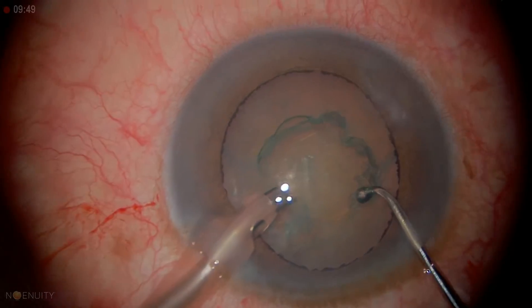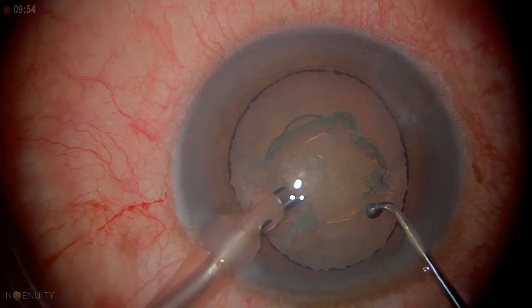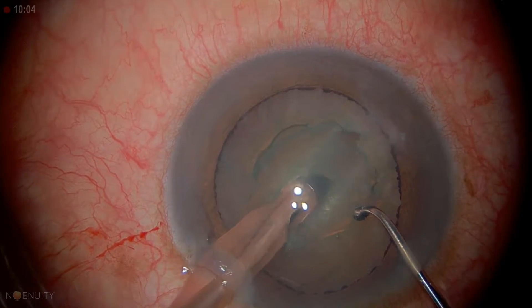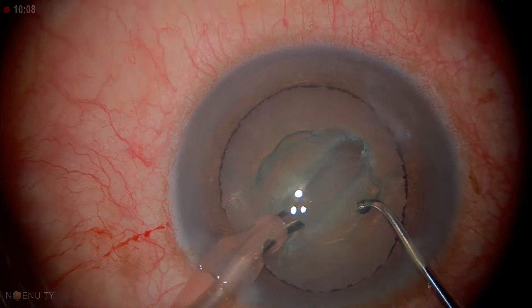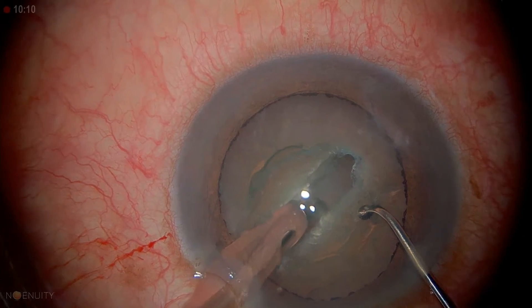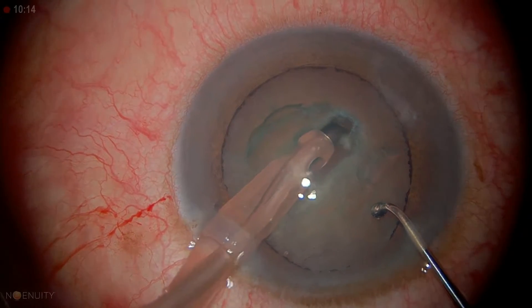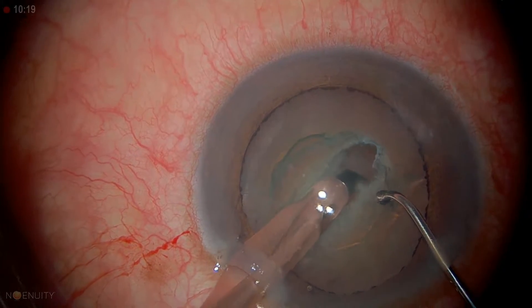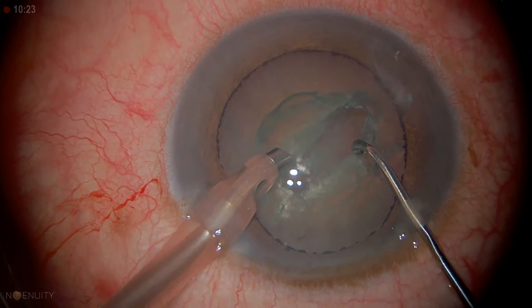We're going to advance it to sculpt, starting superior enough. It's a little dense, which we know. We're not occluding the whole tip — only about 50%.